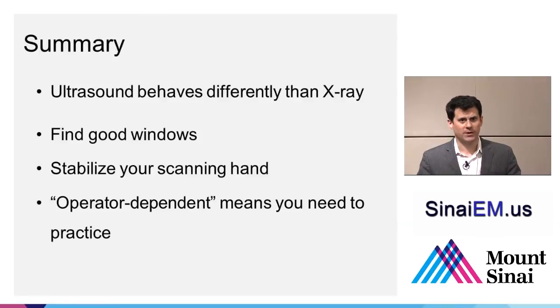And one important thing that should probably permeate all discussions of point-of-care ultrasound and ultrasound performed by traditional providers like radiology, cardiology, and obstetrics. People always describe ultrasound as being operator dependent, and thank God it's operator dependent, because ultrasound is no different than laceration repair. It's no different than EKG interpretation. It's no different than bedside manner. It's something as clinicians that we need to practice and get good at. So operator dependent is not an excuse. It's a call to arms, if you will. It's a reason for you to practice. It's a reason for you to read and learn and get good at this, because like every other thing that we do, ultrasound is operator dependent, and we're going to help our patients that way.